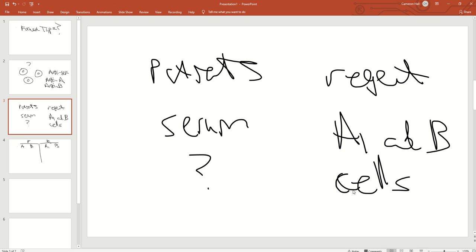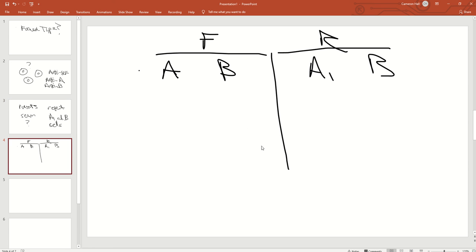These are reagent, meaning you know what they are. They're controlled, basically. These are reagent cells that you buy. And it comes in a little glass vial labeled A1 and a separate vial labeled B. So you know what these are. You don't know what's in the patient's serum. Alright, so back to this.